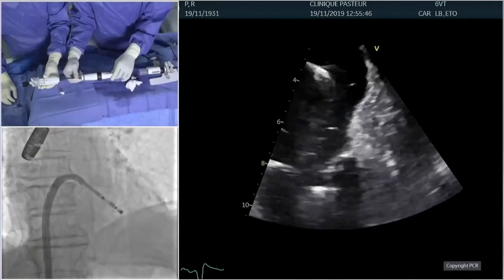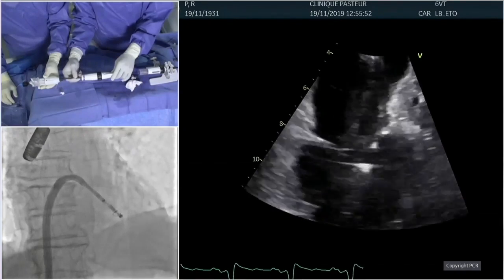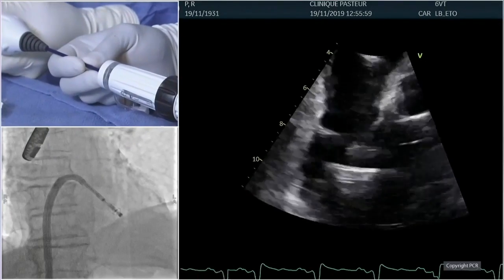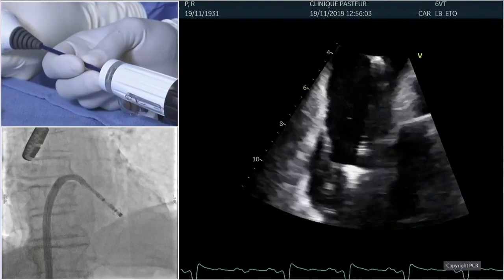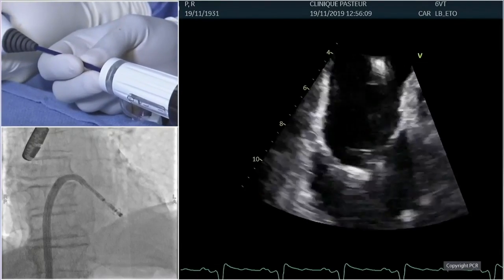So Didier, is the plan to grab both anterior and posterior leaflet at the same time, or will we use the independent grasp features at the beginning? No, what we're going to do is to grasp both at the same time, and if it's too complex, given what we see in real life, we're going to go for the differential capturing. So simultaneous capture first, and then if it's not simple, differential.